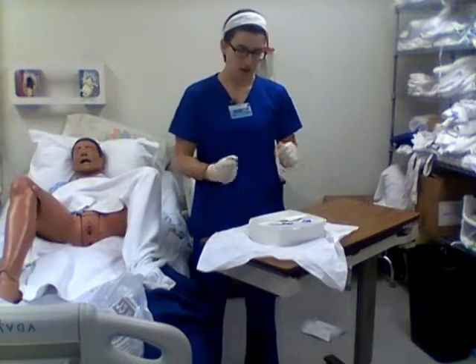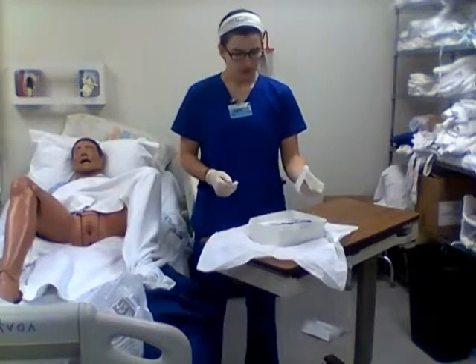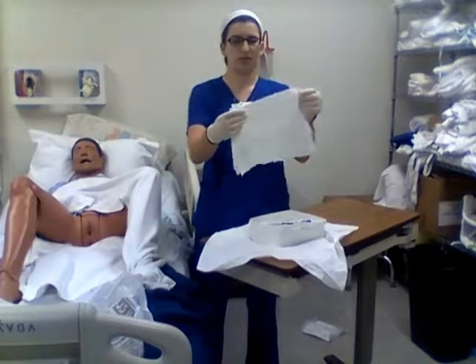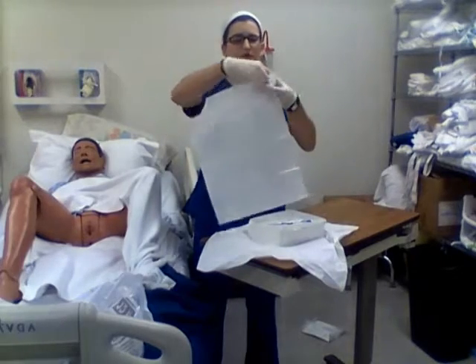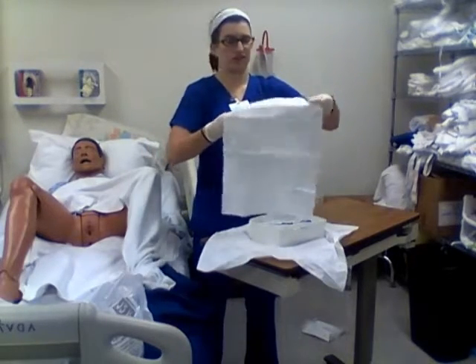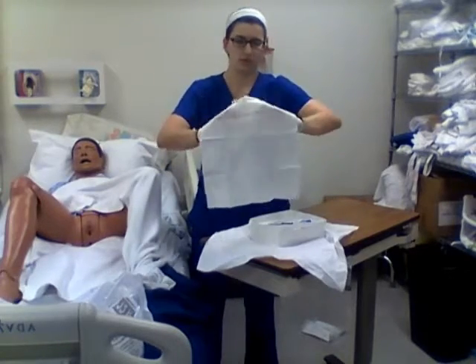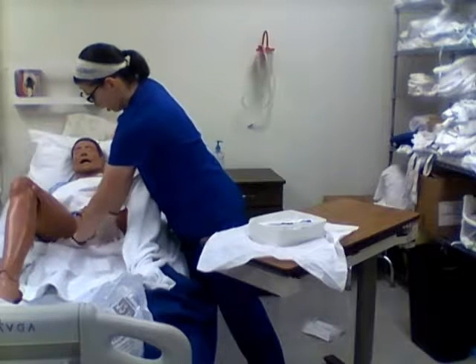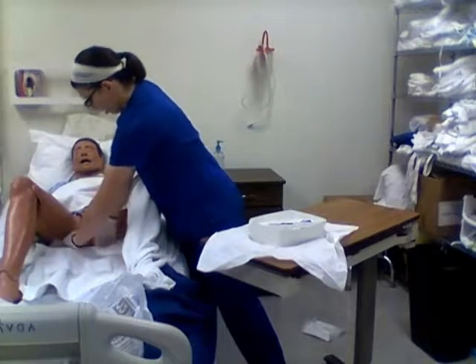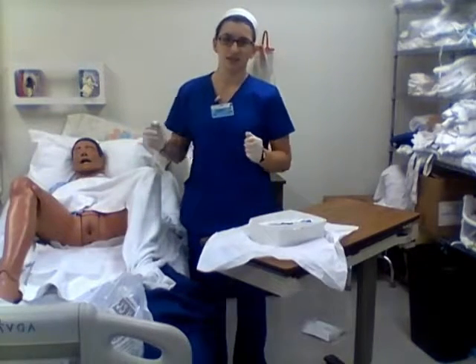And so now we can go ahead, we can get our supplies ready. We can first take our little pad here. We're going to put this underneath the patient. So we're going to have the shiny side down onto the bed. Good. And that is going to be our sterile field down by the patient.